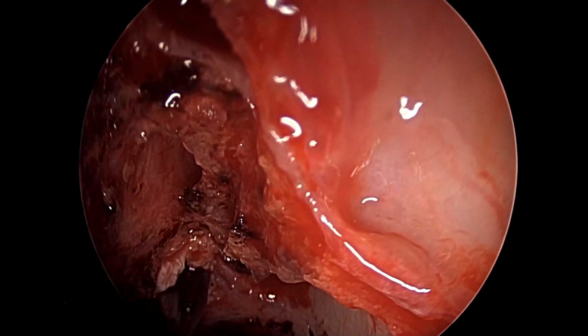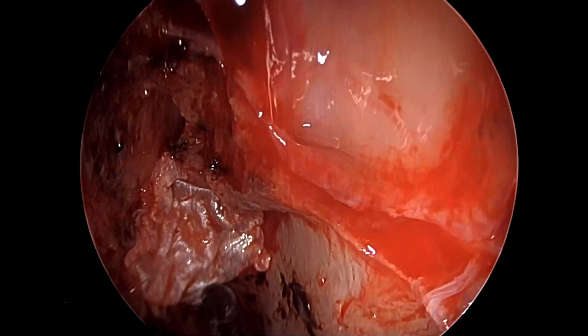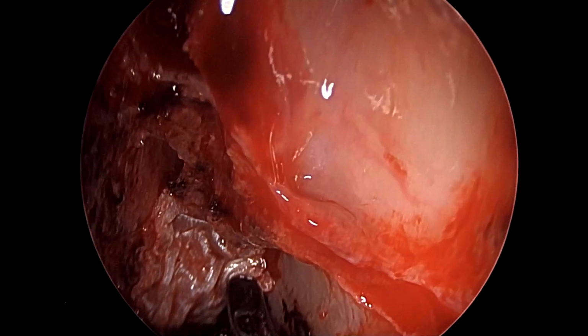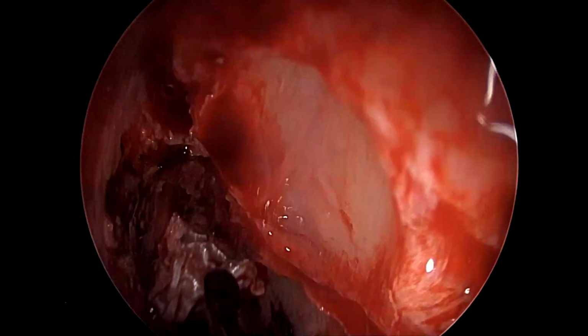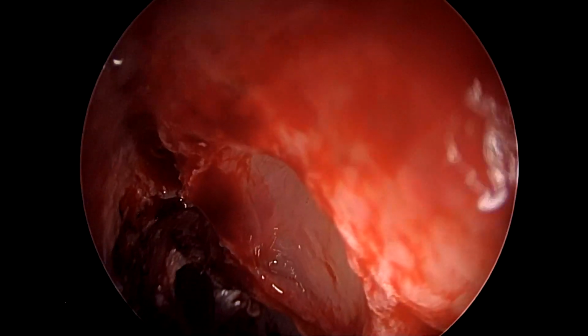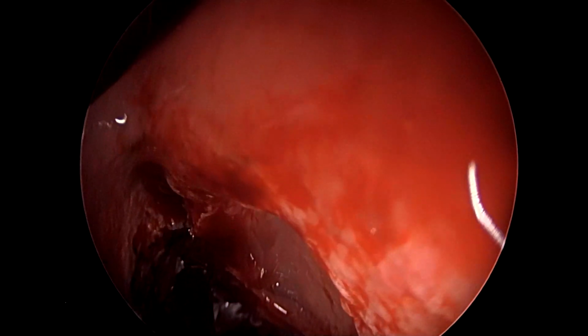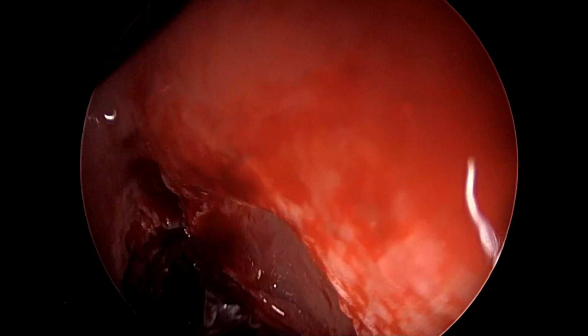Now, as we can see here, our fascia autograft has been reasonably well positioned, and this has now been completed with the use of another fascia autograft in an overlay fashion. This is above the earlier reconstructed fascia, and this is on the bone.